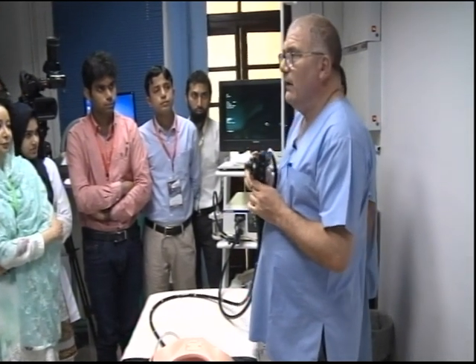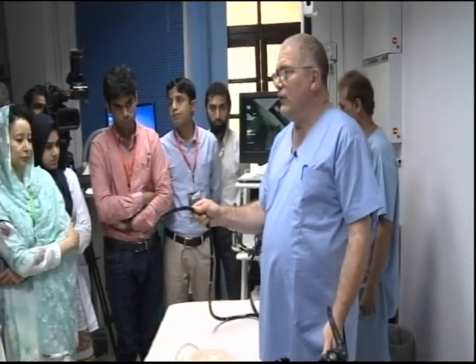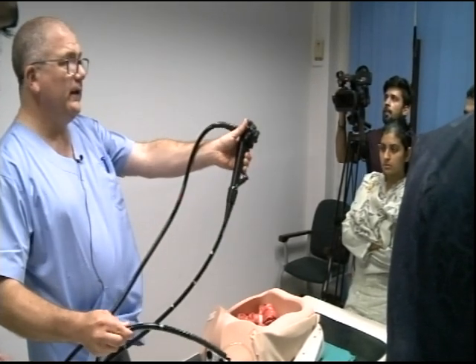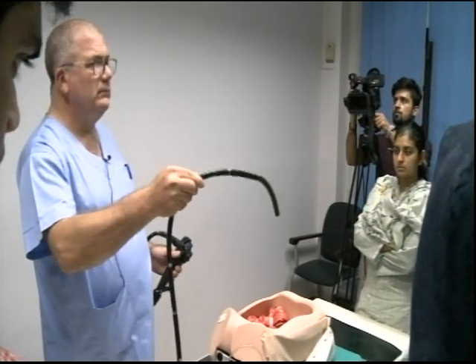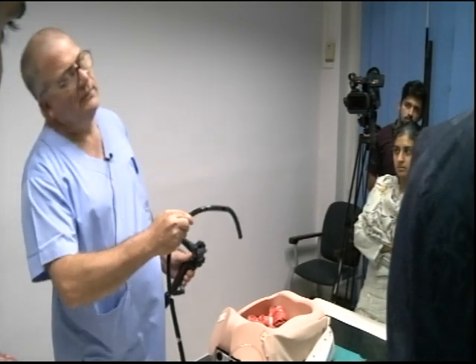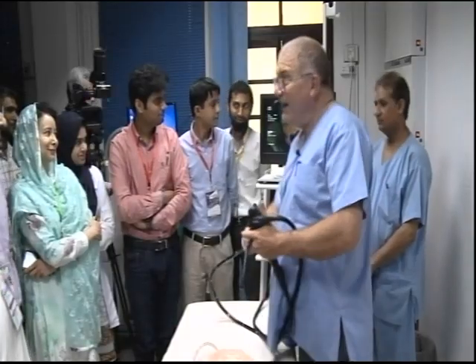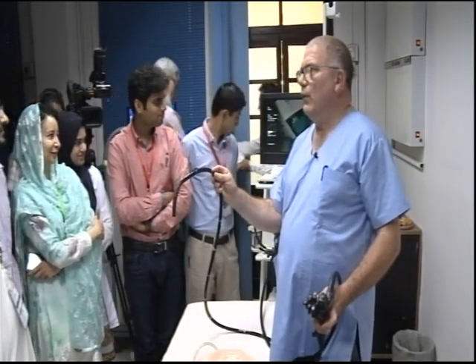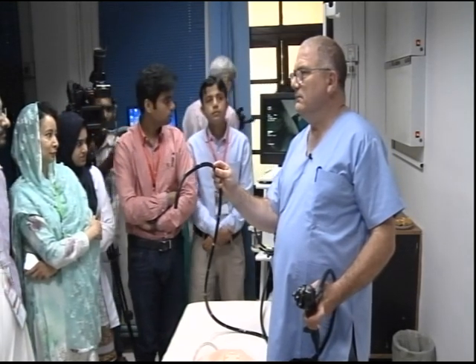Up and down. Up and down. So, I'm pulling it back, so what should that do? If I pull this way, what will that do? Up. So why is it going down? Well, when you look at the screen, you're looking at me. So, when I pull this back, it goes up. So why is that?